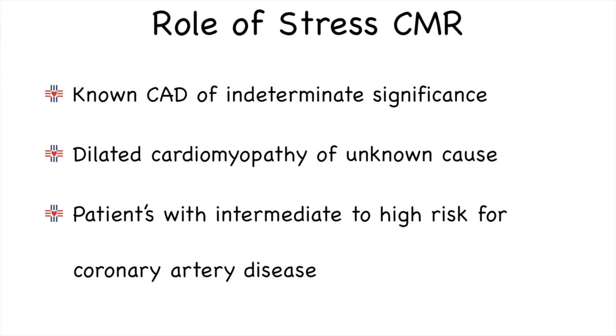It is also useful in patients who have intermediate to high risk for coronary artery disease and are being tested for coronary artery disease. So, for example, if a 70-year-old diabetic and hypertensive walks in with stable chest pain or atypical symptoms, rather than getting an invasive catheter angiography in this patient, it may be better to do a stress cardiac MR and decide further management of the patient based on the findings of the stress MRI.